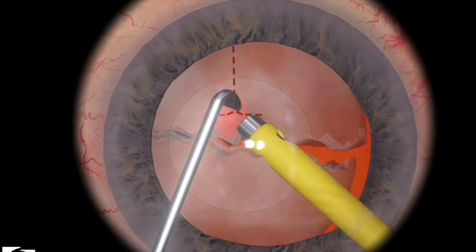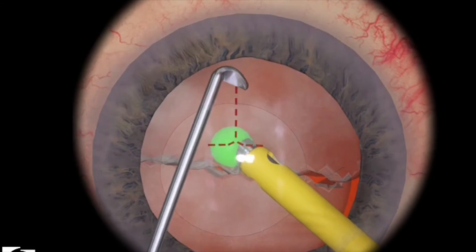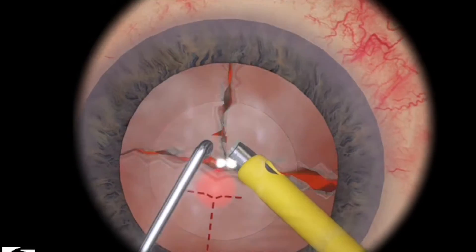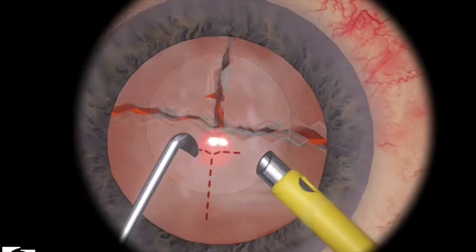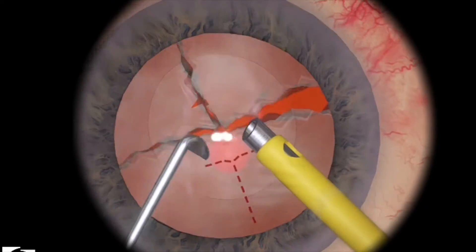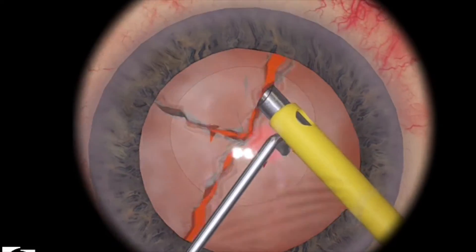Use a little bit of ultrasonic energy. Bury your tip deep inside the sphere until it turns green. Now hold it there in foot position 2. Bring your chopper underneath the anterior lens capsule, and then quickly pull down on the dotted line until the nucleus splits.